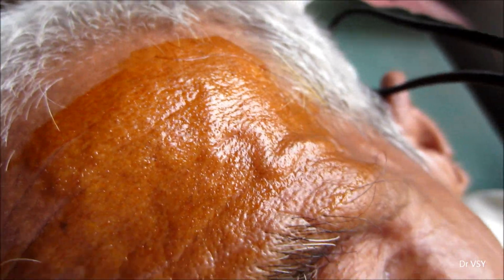First of all, a layer of tincture iodine has been applied on the area and it has been left there for 10 minutes so that it can dry. After that, a layer of starch powder has been applied over that area.